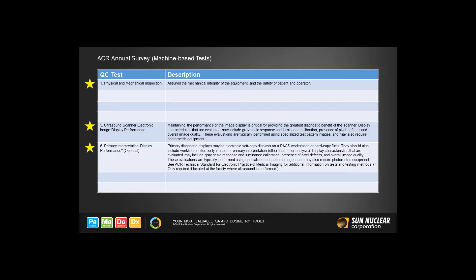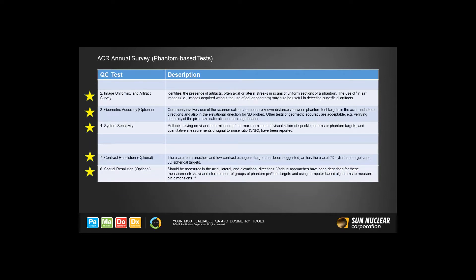These generally are not done using a phantom. Items on ACR's list that are done using phantoms are evaluating image uniformity and testing for transducer element dropout, checking horizontal and vertical distance measurement accuracy, testing sensitivity for all transducers, and evaluating the contrast resolution and spatial resolution. These two items are said to be optional.